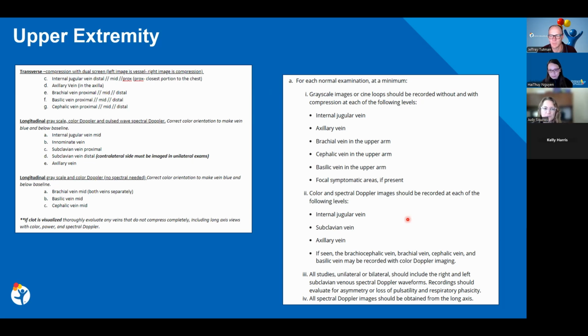What's interesting is we made a shorter vascular access protocol, so just looking at the main vessels, but sometimes they still will only order one side for these higher pretest probability kids for whatever reason. So I'm not sure why they only order one sometimes when we have this whole shortened protocol so that they're not going into the calf on a kid where that's not their question at all. Right. Yeah, we have a similar one.